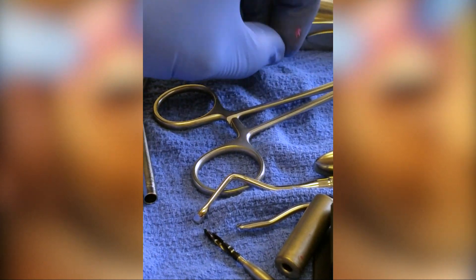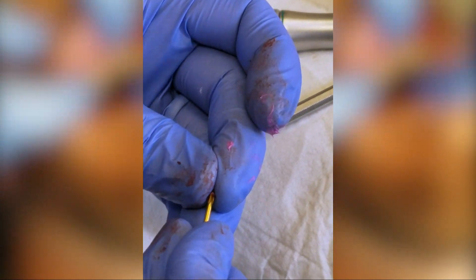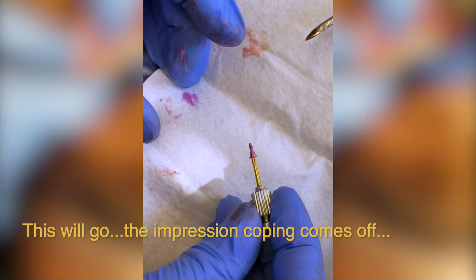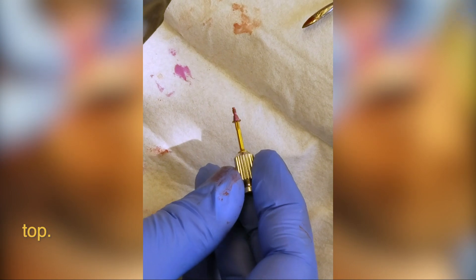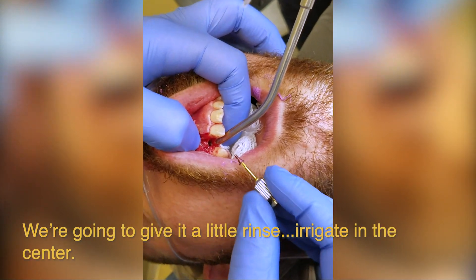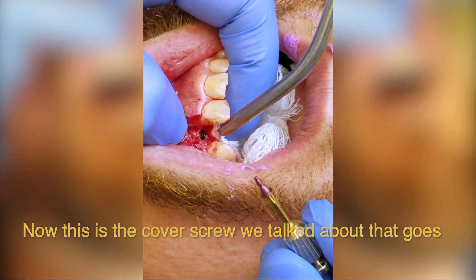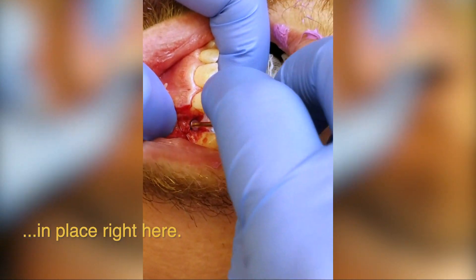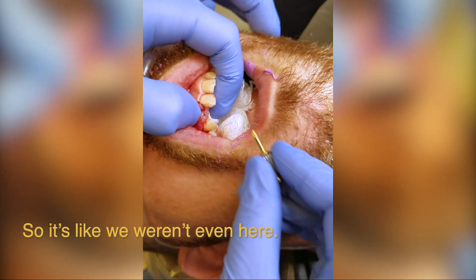Now the cover screw looks like this. Here's our cover screw and the little star grip driver is hiding right here. The impression coping comes off, this goes in, and then the gums will be stitched over top. Implant's in place, a fixture level impression has been taken. We're going to give it a little rinse — irrigate in the center just to make sure it's nice and clean. The cover screw goes in place, and then I need suture — we're going to suture this right back in place, so it's like we weren't even here.